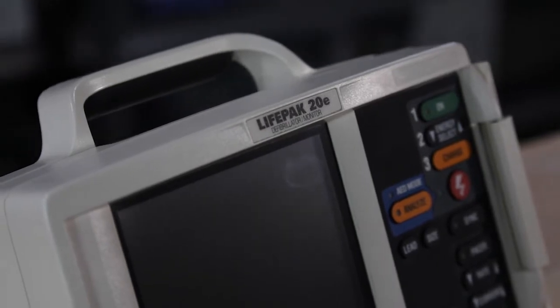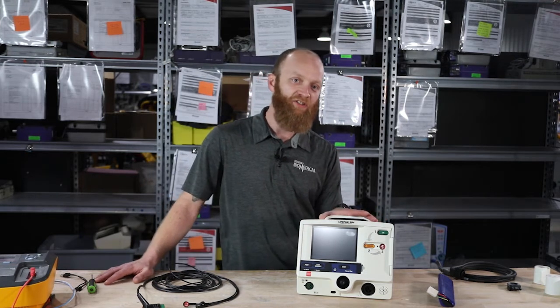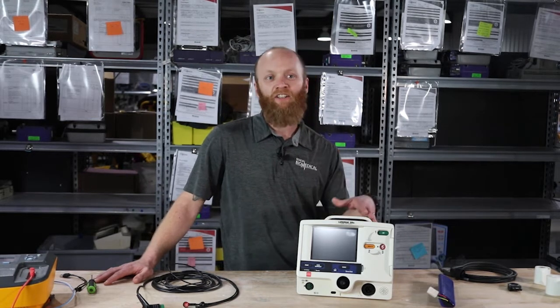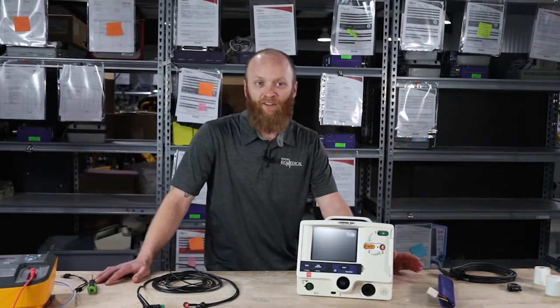The 'E' stands for energy. The early model, the LifePak 20, used a NiCad battery. They went from a NiCad battery to a lithium ion — so better battery, longer shelf life, and longer lifespan overall.